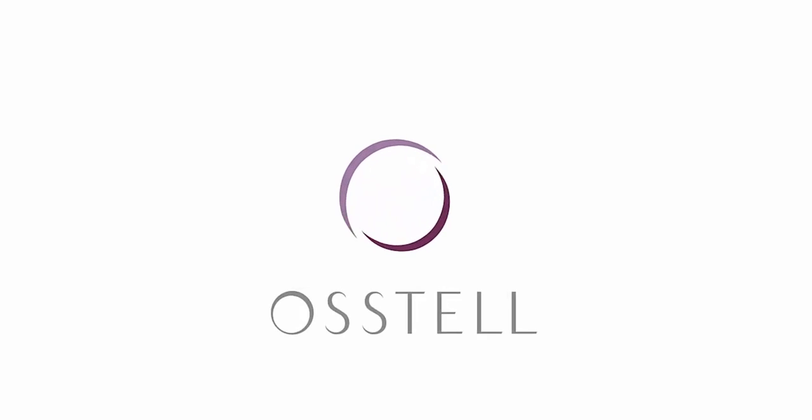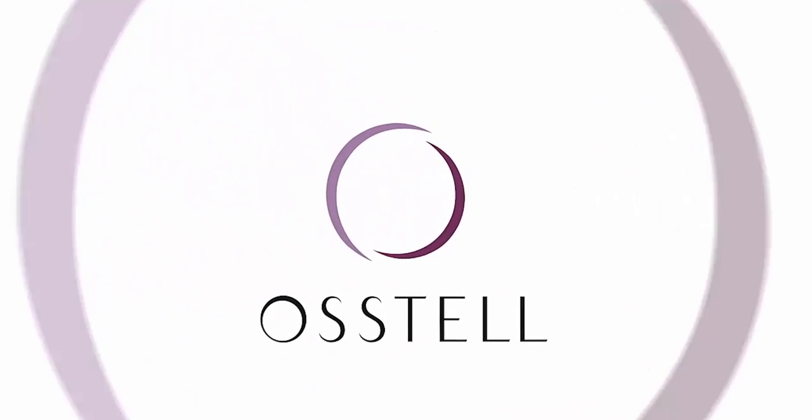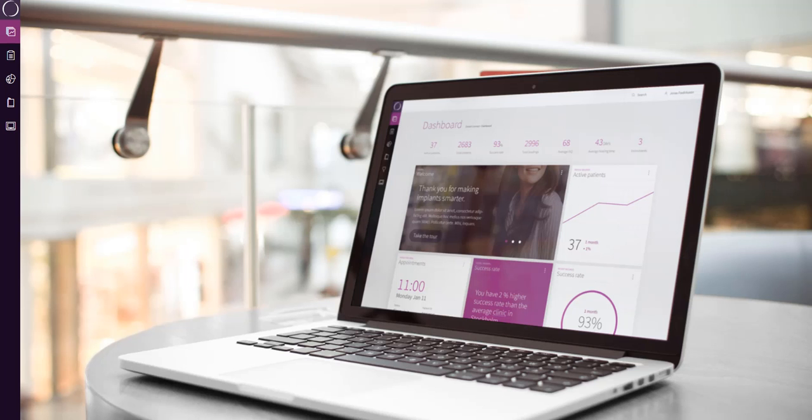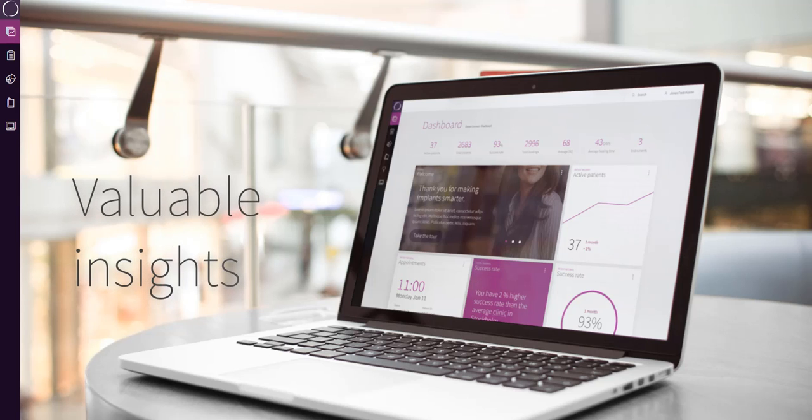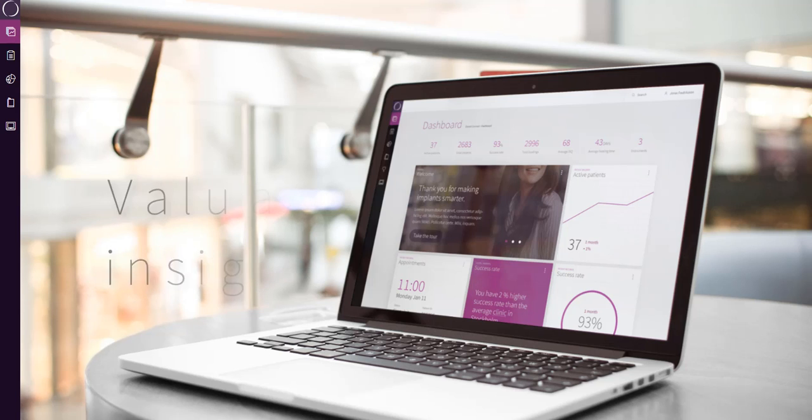Hi, and welcome to Osstell Connect. Osstell Connect is an online service that provides valuable insights of your daily implant treatment performance.